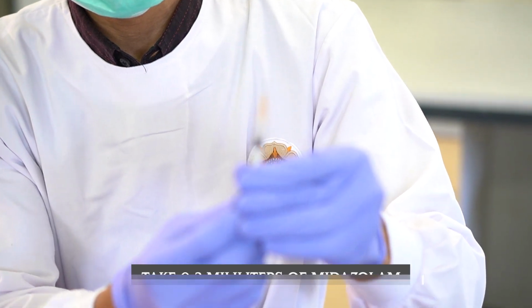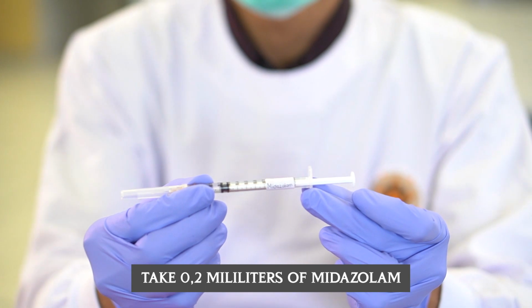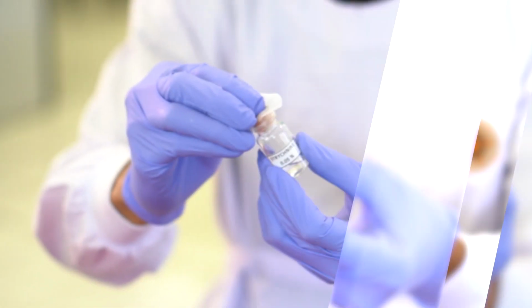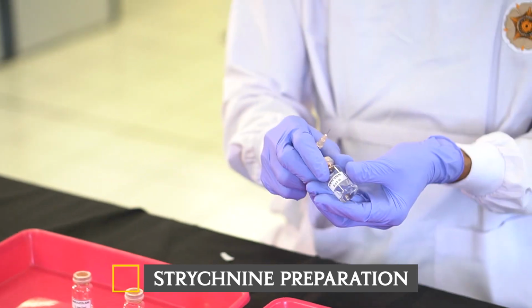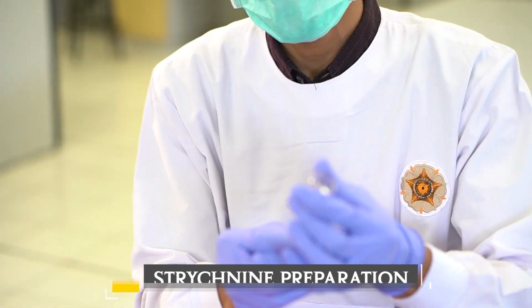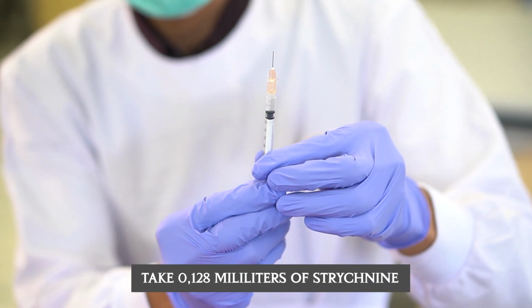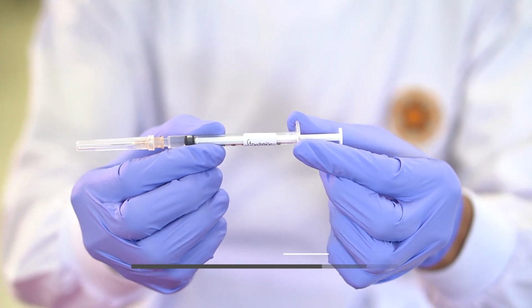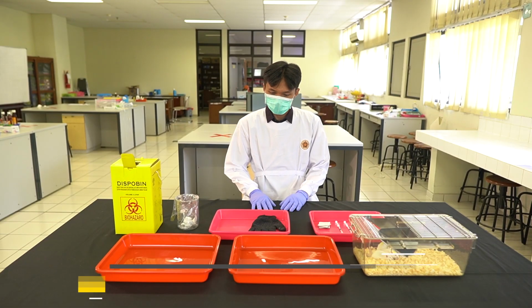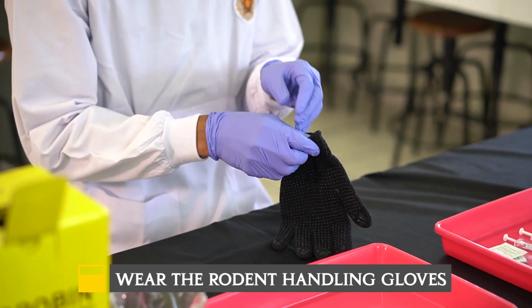Take 0.2 milliliters of midazolam. Strychnine preparation. Take 0.128 milliliters of strychnine. Wear the rodent handling gloves before holding the mouse.